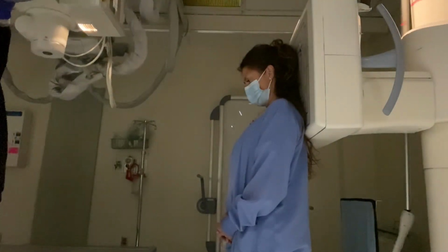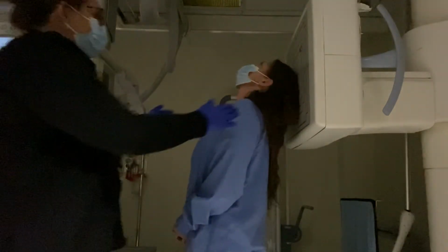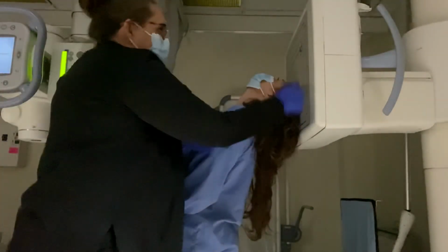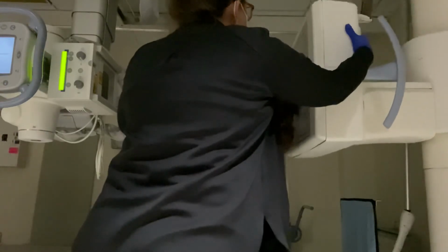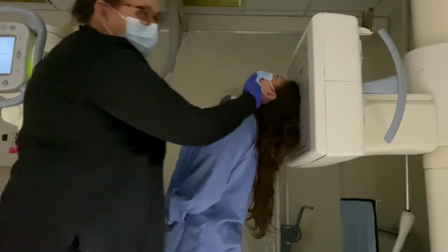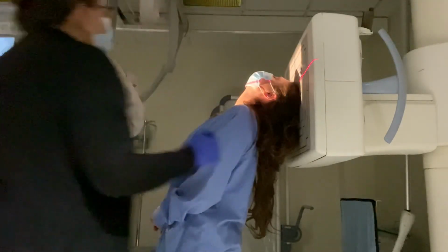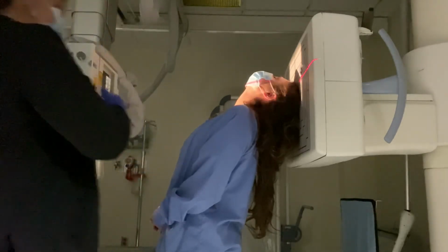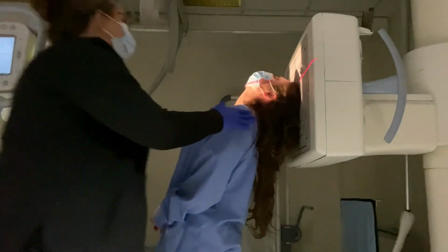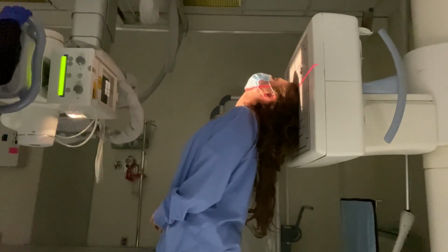And then the last one I would do is the SMV. Do you think you can do that standing up? Mm-hmm. Usually you have your patient about 12 inches away from the board. And then, this is more down. You want to make sure, again, that the IOML, the inferior orbital meatal line, is parallel to the IR. You're going to center 3/4 of an inch above the EAM, or usually, I'm going to move you just a little bit, right in line with the gonions of the mandible.